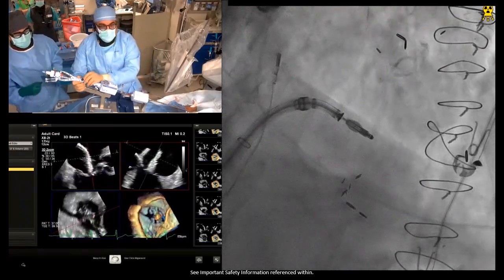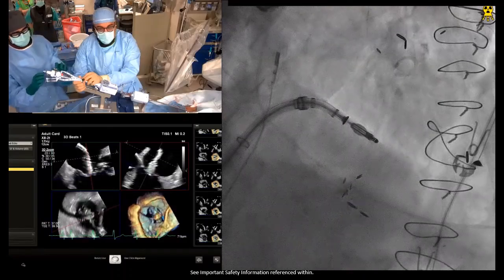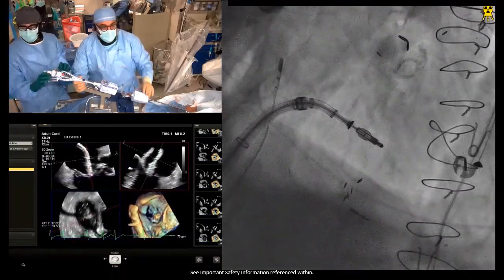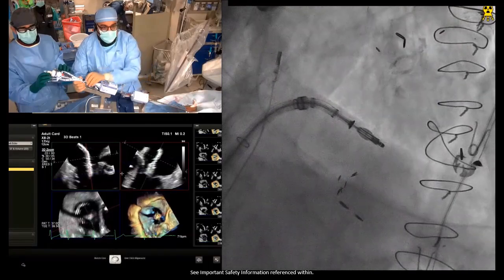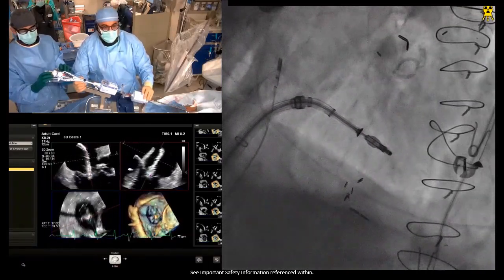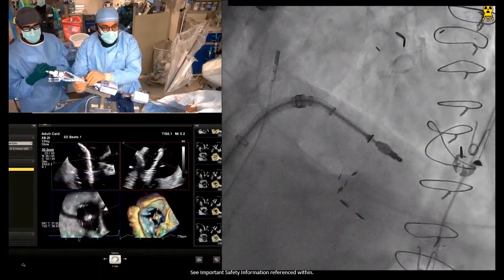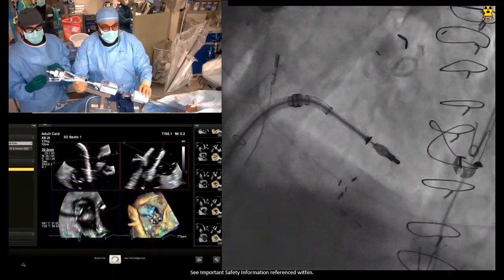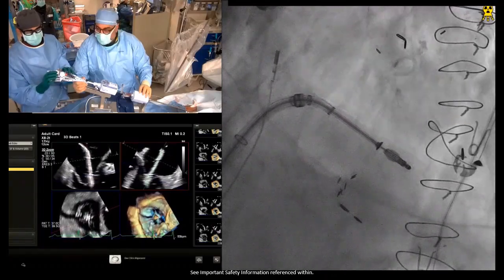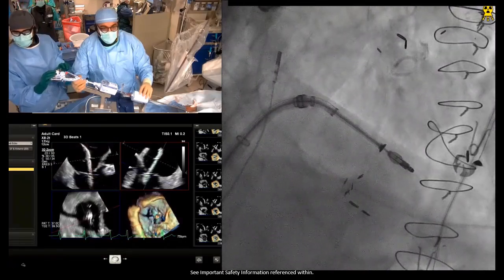Oh, yeah. Arms are closed. So arms are closed there. Yeah. So I'm going to go ahead and start advancing in. That's about 1 millimeter advance there. My alignment hasn't shifted. My position in the inflow view looks pretty good, Edris. Advancing in a little bit more. Just rotated just a little bit anterior. Advancing in a little bit more. Advancing in. Okay, so we should be below now. My parallax is pretty much maintained on top there.